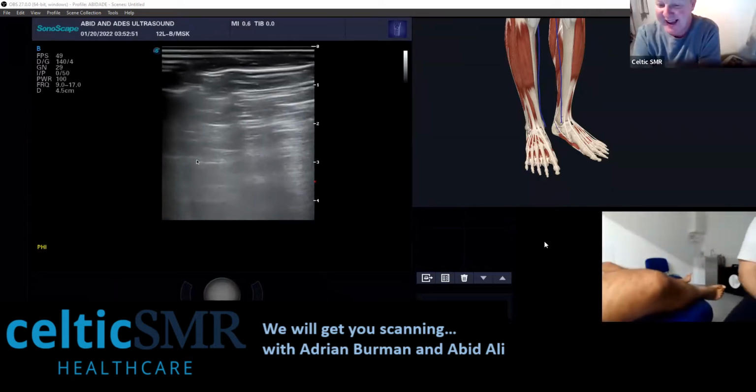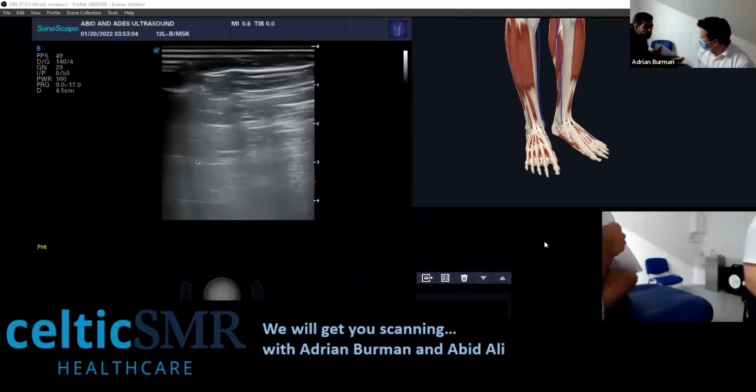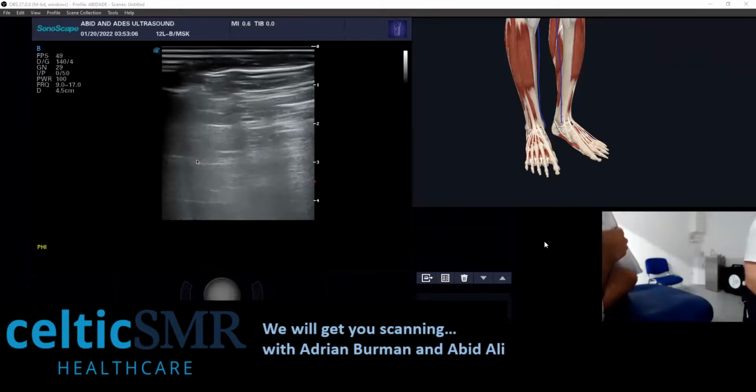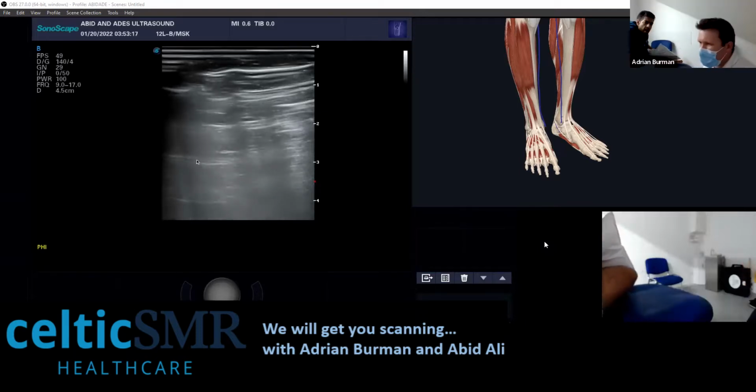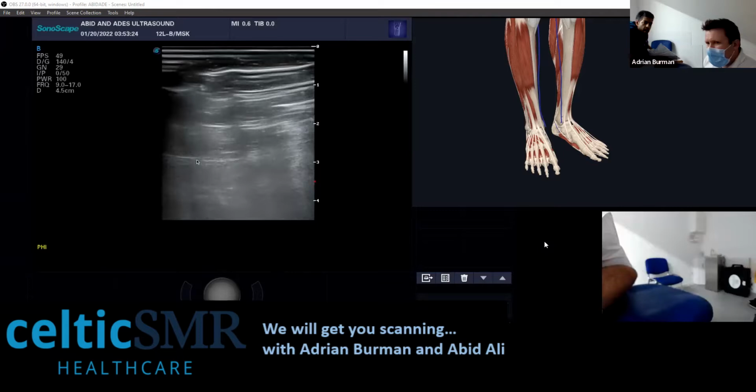Hi, Olga. Hello, Olga. Hi, I've got a question with regards to gastrocnemius and soleus muscle group, and when we look to explore the region for some scarring following old injuries. So when you're assessing that musculature and the fibers, there will be an amount of normal thickening because of the activity levels and the scarring. So making that differentiation between muscle fibers versus scarred fibers, what would your go-to process be?